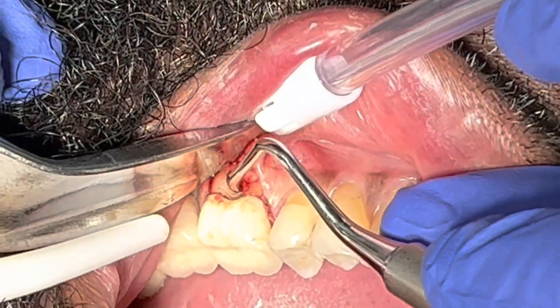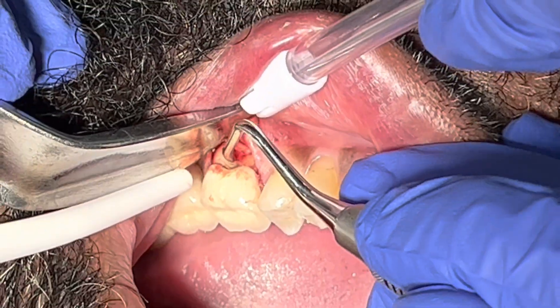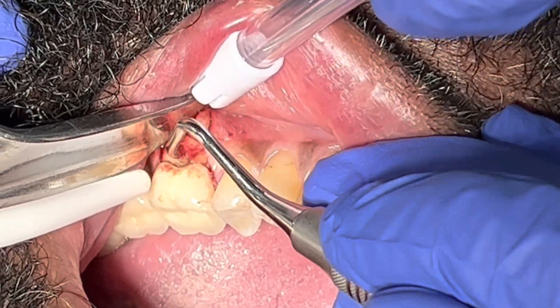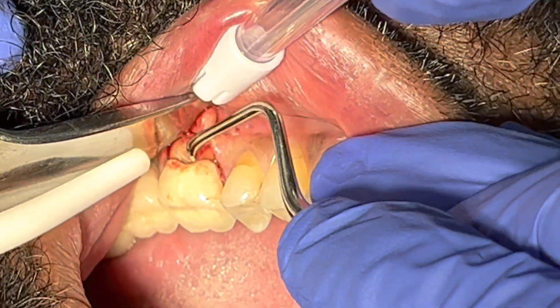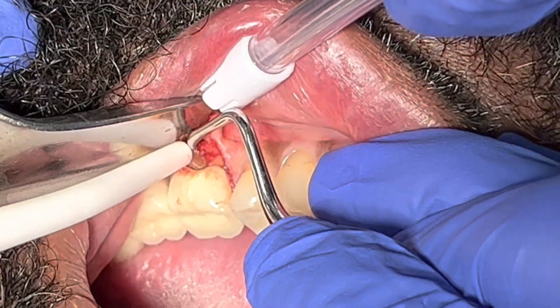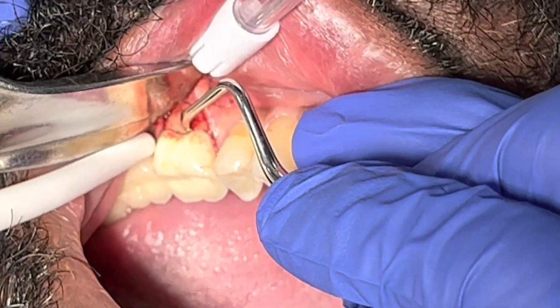I can see there is more distal bone loss compared to the mesial bone loss. The margin is just a little overhanging and sits below the gum area. I'm continuing to remove everything considered to be preventing new attachment.